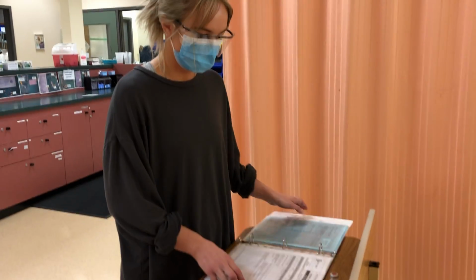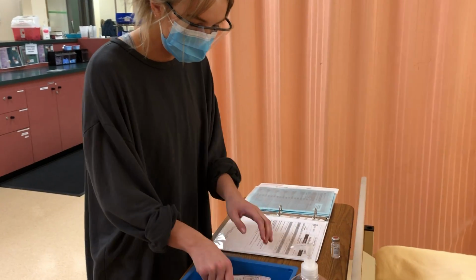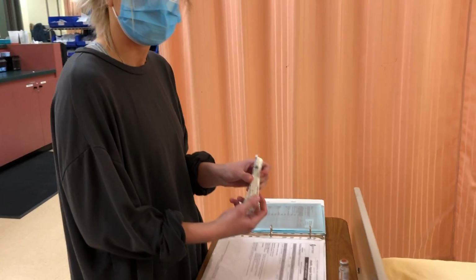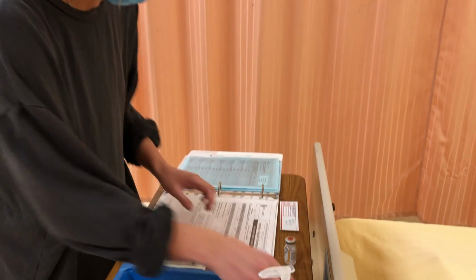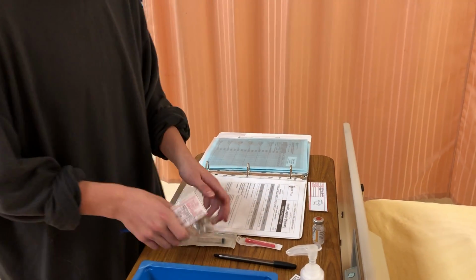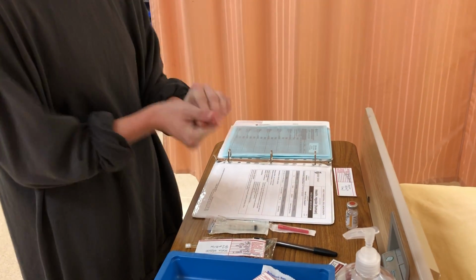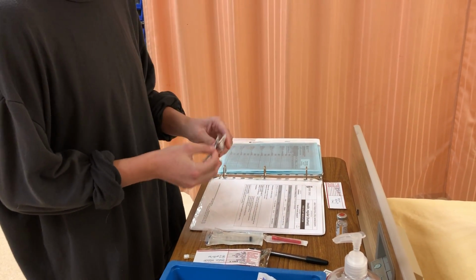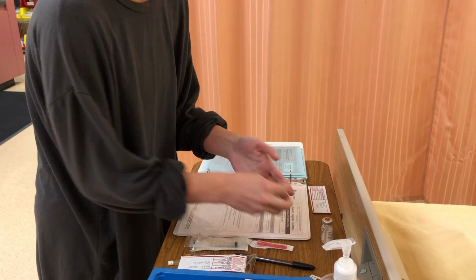So now I can start to draw my medication. I've done my first check. As per the PDM, we need a 3 ml syringe. So I have a 3 ml syringe. I'm going to be using a blunt fill needle to draw from the medication, and then we will be injecting it into here. So I'm going to do my hand hygiene before I deal with the medication. We know it's the right med, so I'm just going to clean for 30 seconds, let dry for 15.